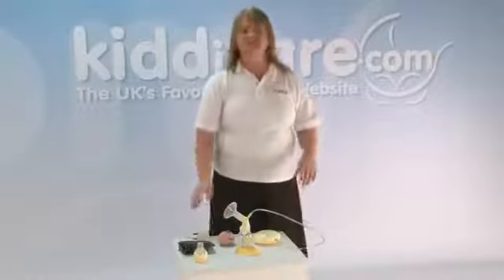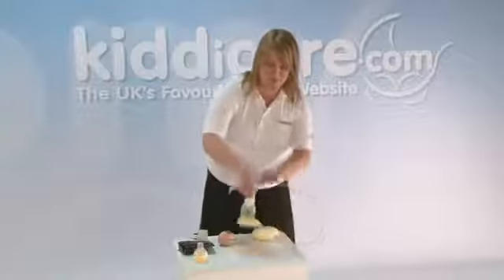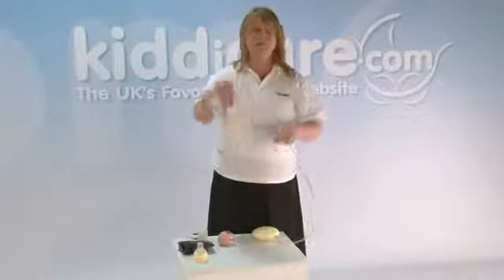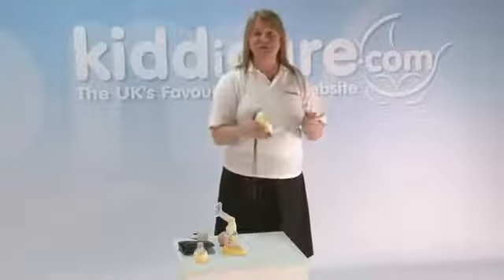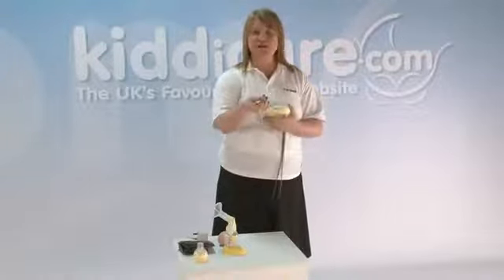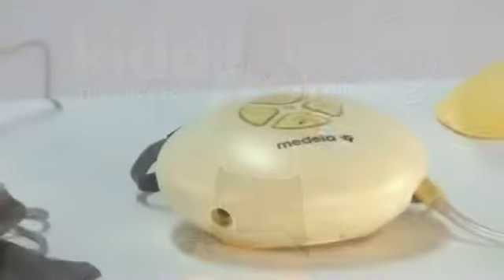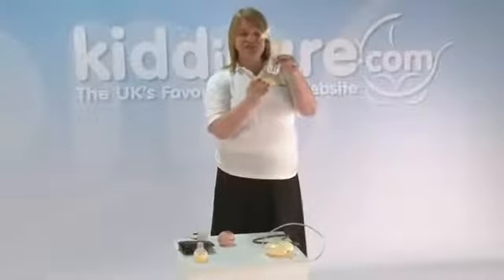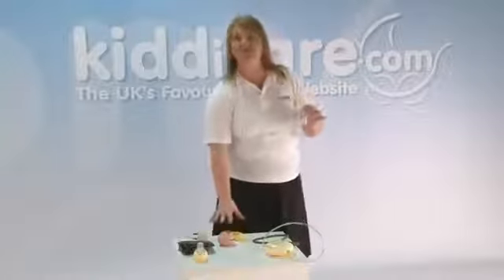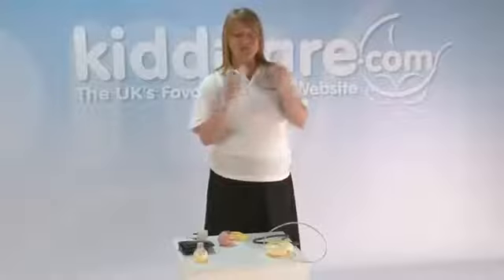To show you how the pump goes together, what you'll need to do for cleaning is to pull the tubing from the bottle unit. This part obviously doesn't want to be submerged in water. We don't need to wash the tubing either because it's just air going down here. So keep these parts dry and to one side. You've got a stand just to make sure it's secure on the worktop, so take that off, that's not coming in contact with the milk either. And then everything else is either screwed off like that or pulled apart.